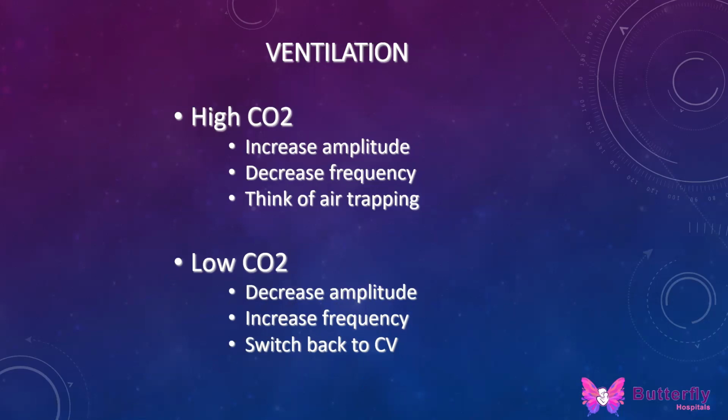There are situations where you can directly extubate the baby from high frequency ventilation, but the most regular practice is changing from high frequency to conventional ventilation. The best way will be volume guarantee ventilation, and then wean off the volume guarantee ventilation onto CPAP.